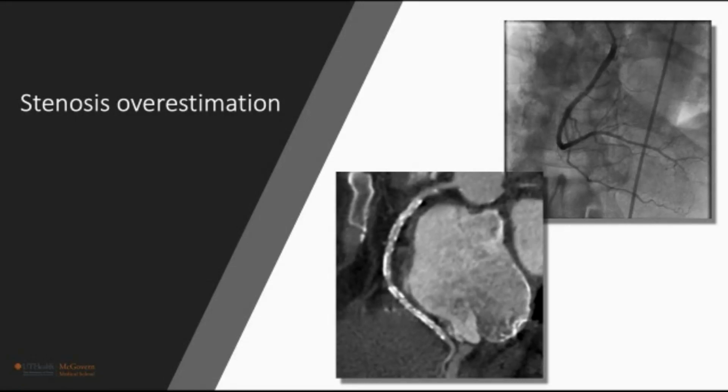We all have gone through the growing pains of early reading when we tend to overestimate the lesion, and we have difficulty, and still today, seeing through cardiac stents, seeing through lots of calcified lesions, and next thing we know, we send the patient like this to the cath lab, and the phone call comes back quickly.